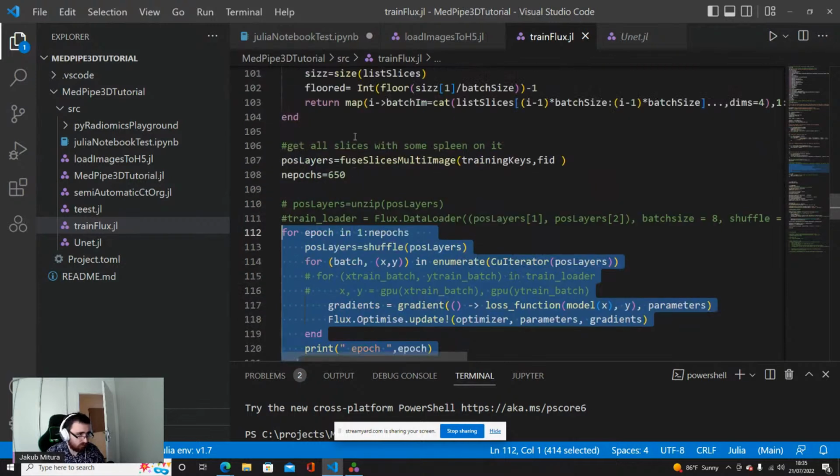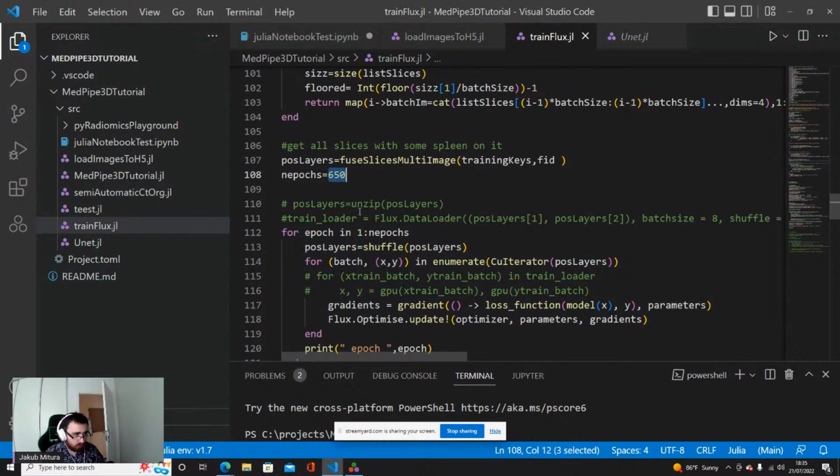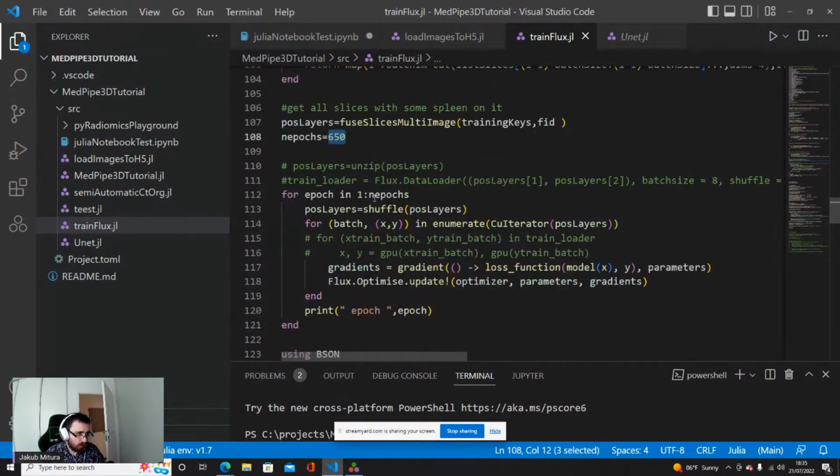I had chosen 650 epochs, so it will take a couple hours to train. During the training I shuffle the layers. It can also be achieved more cleanly in the train loader by changing shuffle to true.